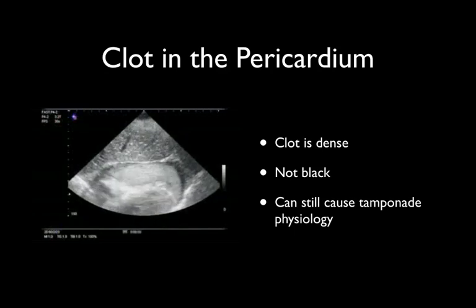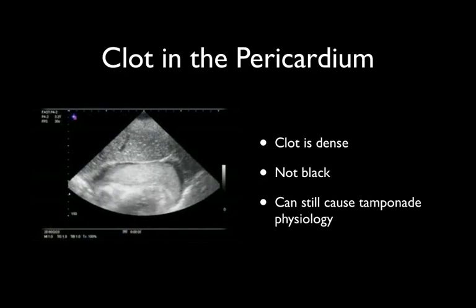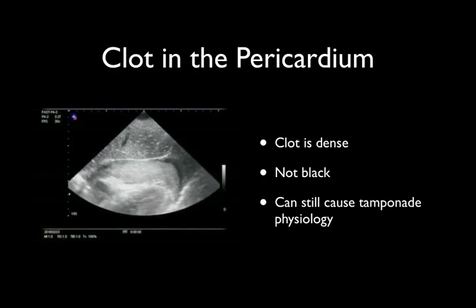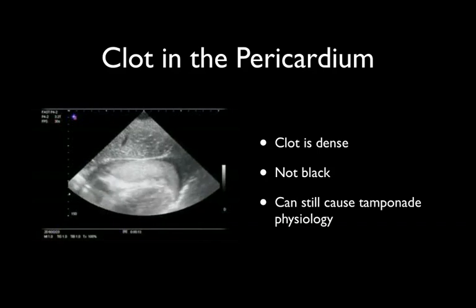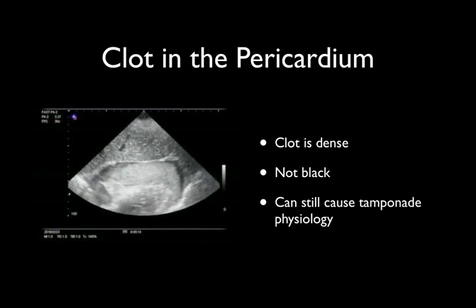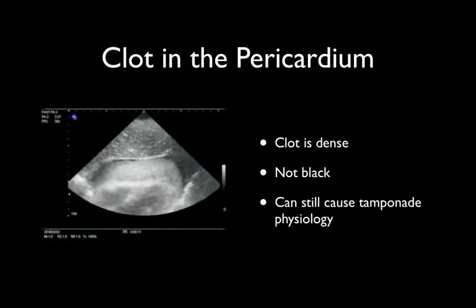Not all pericardial effusions are black. This is an example of clot within the pericardium, which can occur in traumatic pericardial tamponade or postcardiotomy. Even a smaller volume within the pericardium can still cause tamponade physiology — as little as 50 mils of clot can cause tamponade.